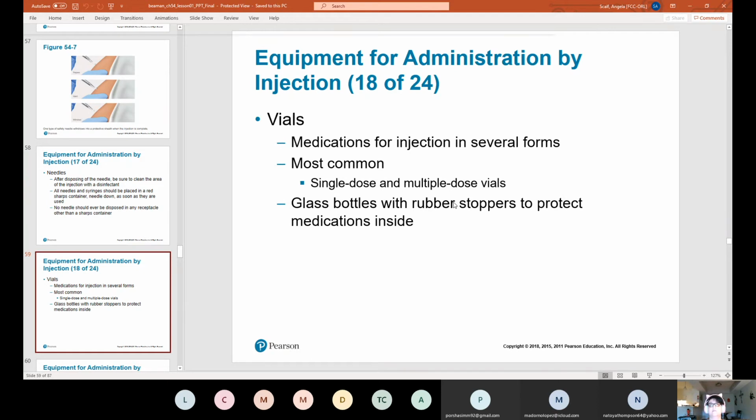There's a reason that right now I'm going to go over some rules with you. When you have a vial, even if it's the very first time it's been pulled out of the box and you're the one that gets to flip the lid off, which is very satisfying, we're still going to clean it. We're still going to take an alcohol prep, even if you're like, well, it just came from the manufacturer. My OCD doesn't allow that. We clean the top of the vial, because we're going to build that muscle memory of always cleaning it.